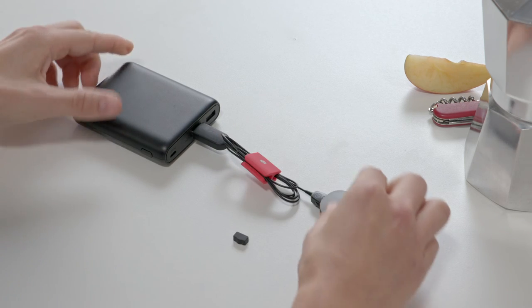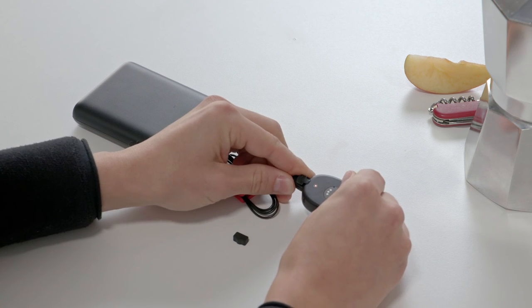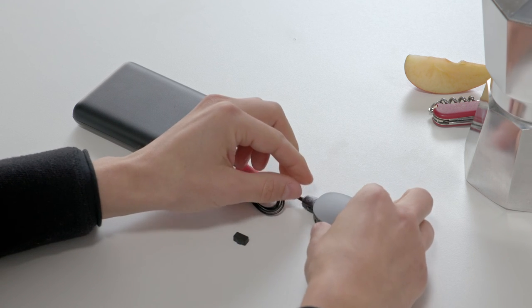The RONDO 3 charging cable can be connected to power banks, computers, TVs, or other USB power sources. So there you have it, incredibly simple charging with RONDO 3.